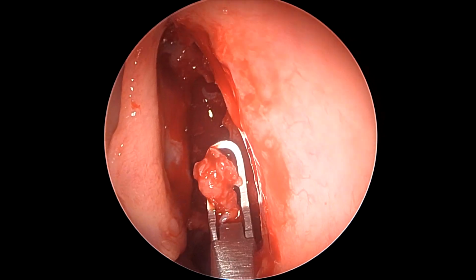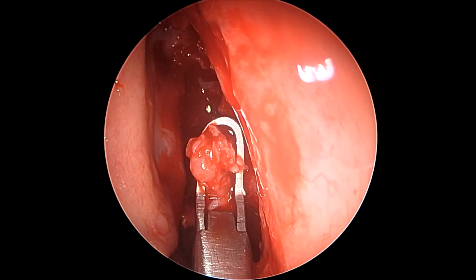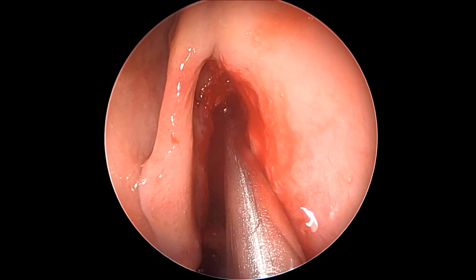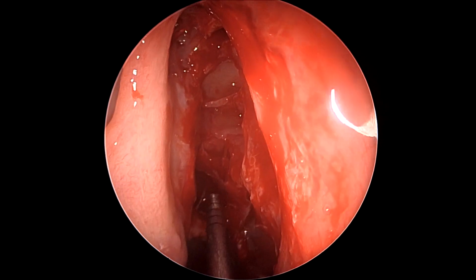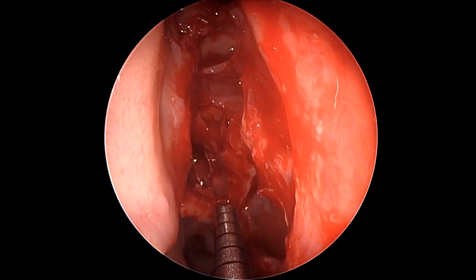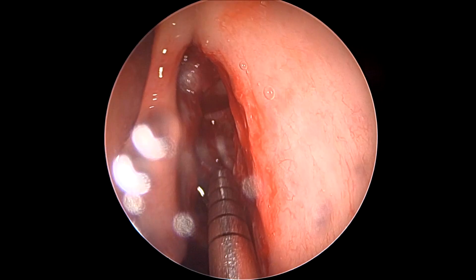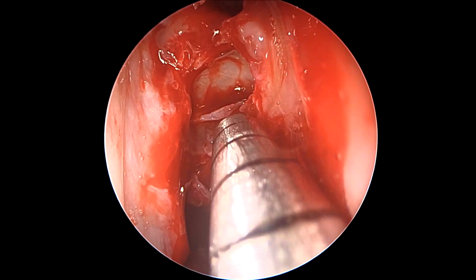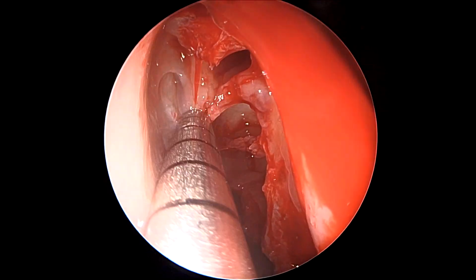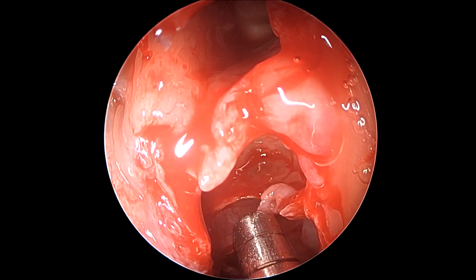These septations, when removed flush with the lateral nasal wall, the lamina papyracea and the skull base, ensure a complete ethmoidectomy and easy access into the ethmoidal sinuses for not merely disease clearance, but also post-operative examination using office endoscopy. Here we are using a navigation tracking suction to clear all the clots while seeing the ethmoidal skull base very cleanly here. The frontal recess is also visible here, just behind the frontal beak.